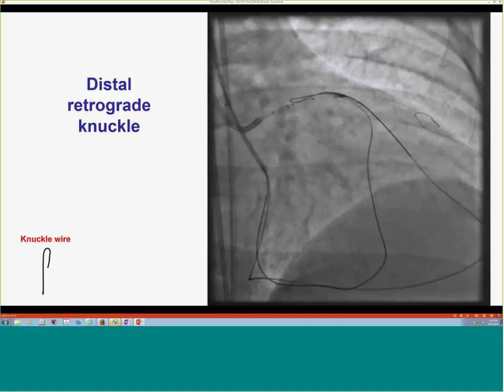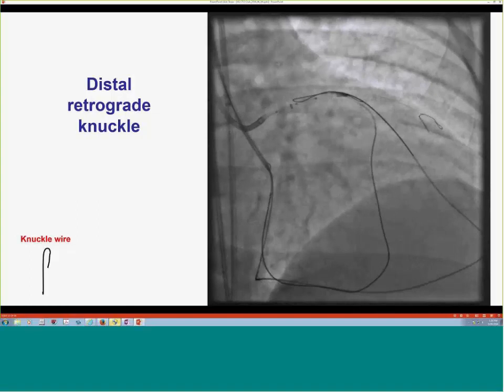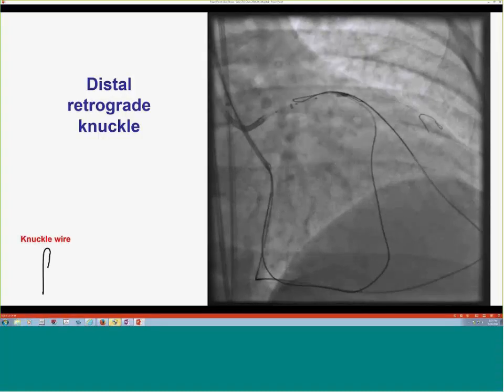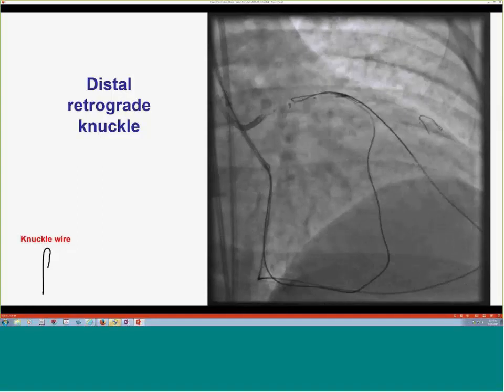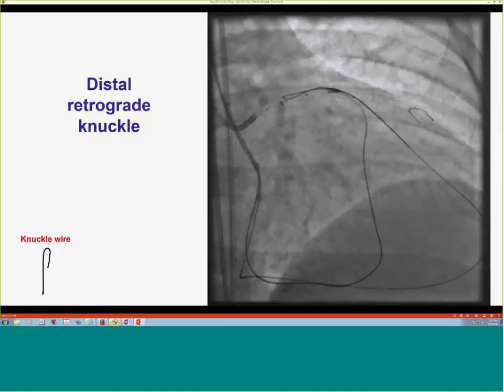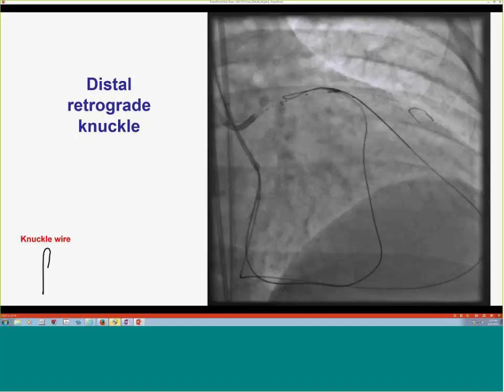So in this situation, have you seen much ischemia from all these tubes blocking flow on both sides? Yeah, I have. I mean, that's the first double retrograde I've done, so I haven't done much of putting multiple Corsairs retrograde. But when you have a major epicardial dominant collateral and you close it, that's when you get ischemia. I've seen bradycardia. I've seen actually people get asystole and arrest from this.